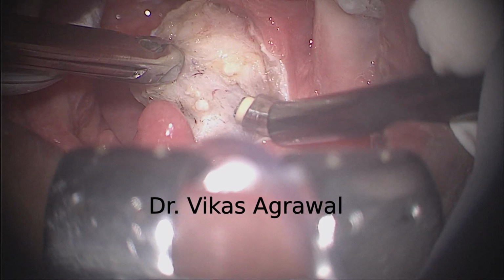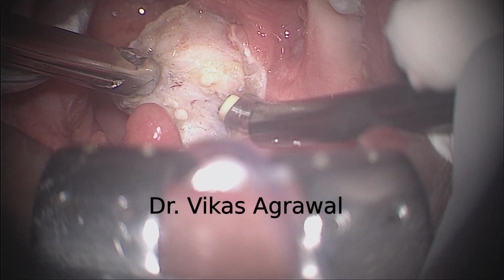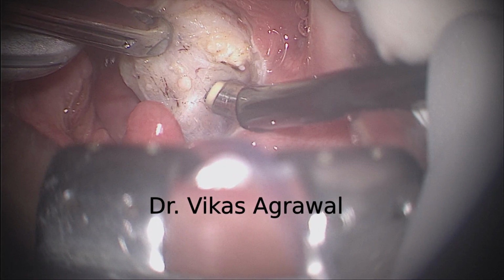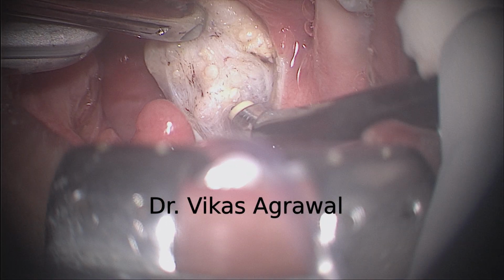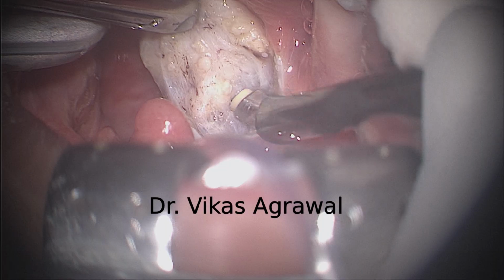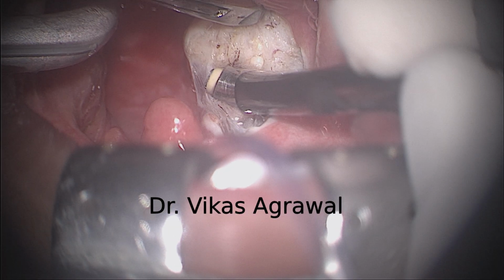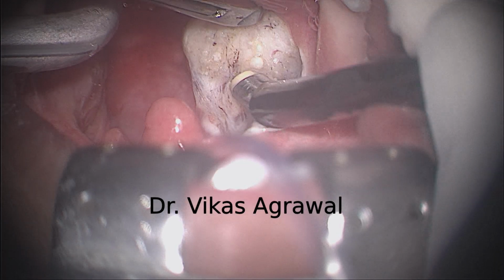Now see, this is the tonsil tissue again. This is a cotyledon of the lymphoid tissue which is buried inside, so I have to dissect that out.